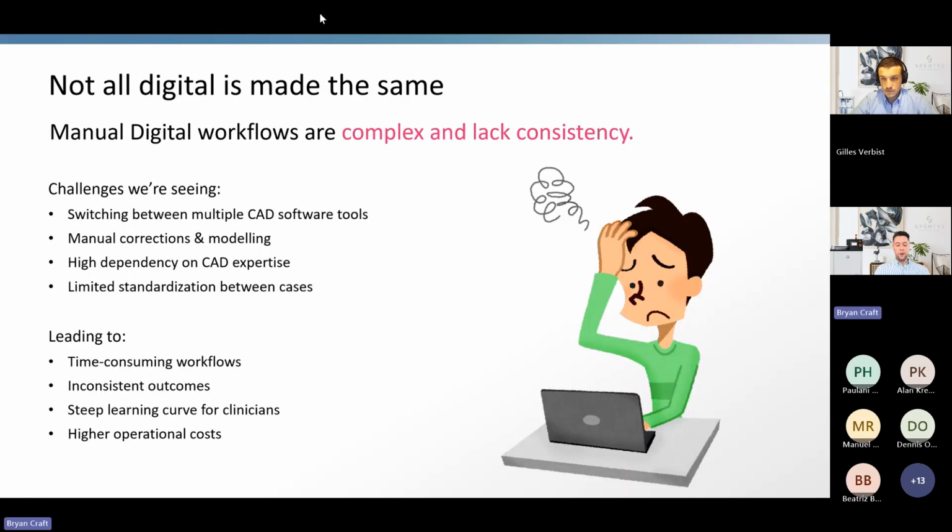I have one of our partners, Certified Orthotics in Colorado. They started using footForma because before, they had multiple different CAD systems, one of which had like 30 different buttons at the top of the CAD system.